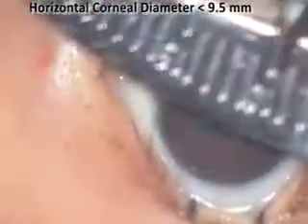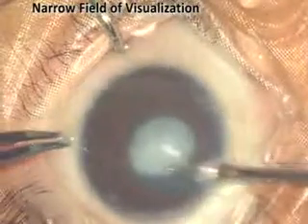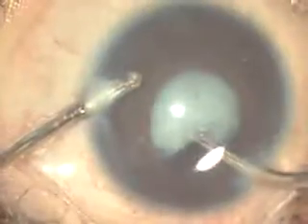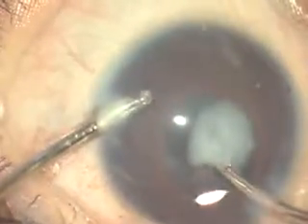Microcornea in rubella cataract provides a narrow field of visualization along with a high risk of endothelial decompensation. Aspirate the lens matter in the bag using bimanual irrigation and aspiration. Then, make both the anterior and posterior capsular openings using an automated vitrector.